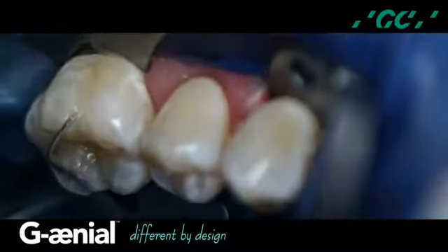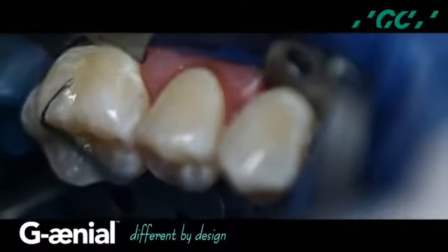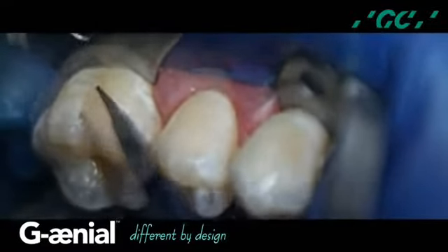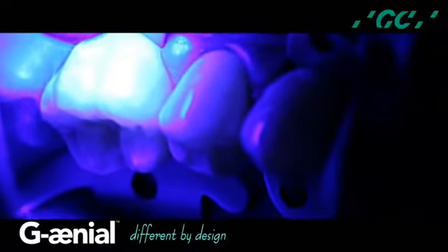A final enamel layer of flowable AE G-aenial universal flow is applied with an explorer tip to the buccal surface and adapted using a double-aught sable brush. Notice the optimal marginal integration from this controlled fluidity of the material, and light cure for 10 seconds.